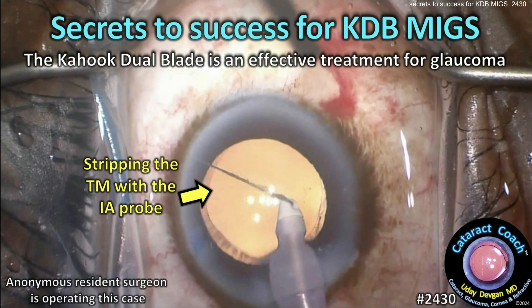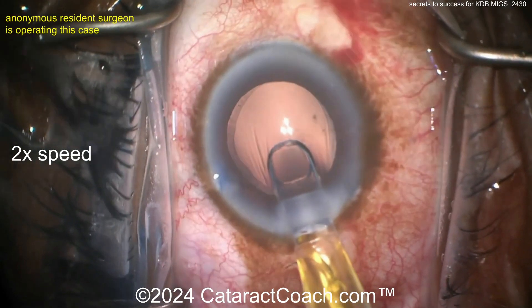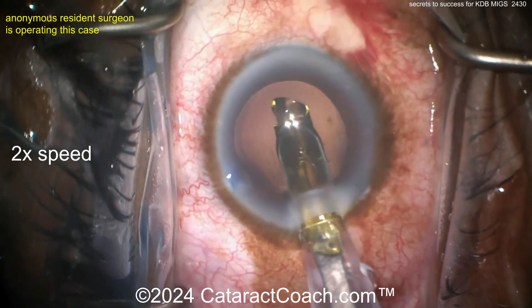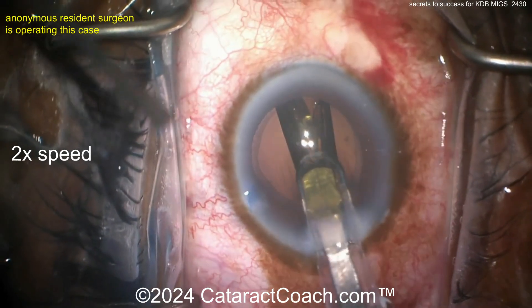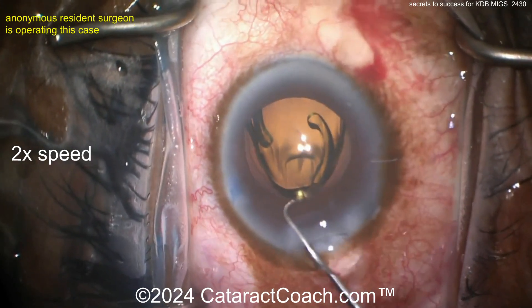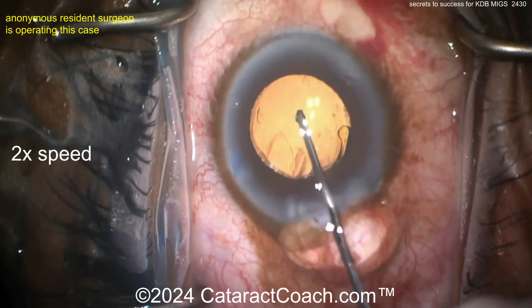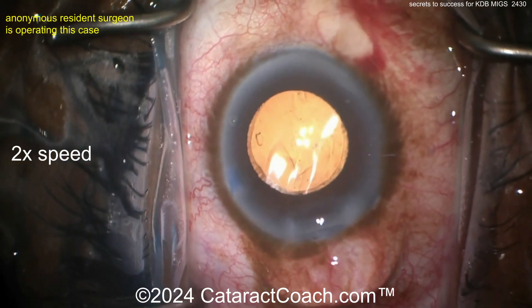CataractCoach.com secrets to success for KDB MIGS. The Kahook Dual Blade is an effective treatment for glaucoma in this minimally invasive procedure. At the end of the cataract case, the eye is full of viscoelastic. The IOL is going in the capsular bag — make sure you have a nice overlap of the optic by the capsulorhexis. A monofocal lens is probably the preferred choice in a patient who has concomitant glaucoma.